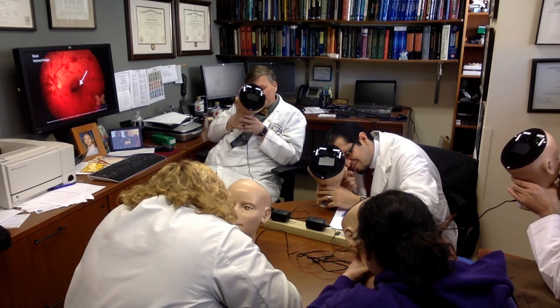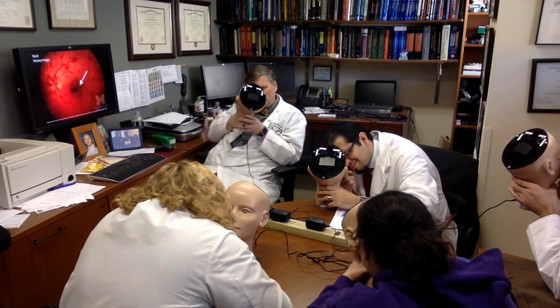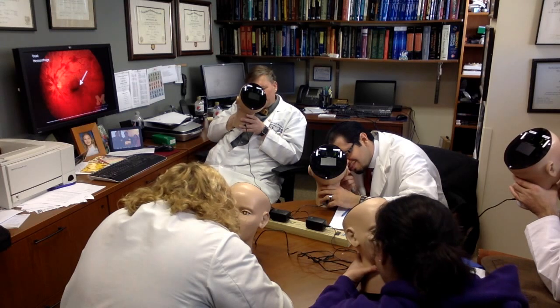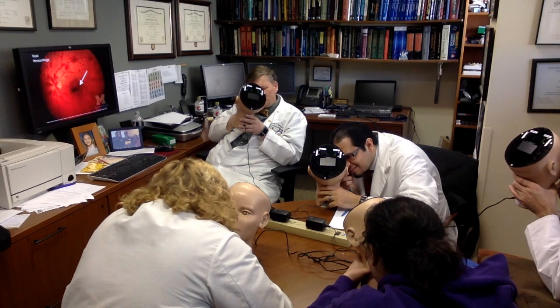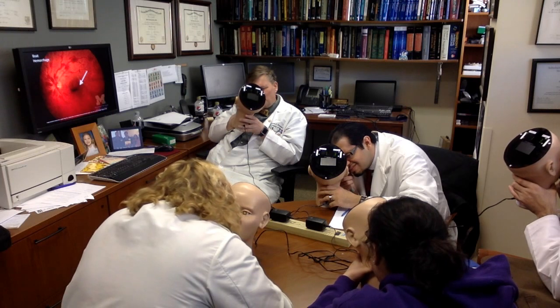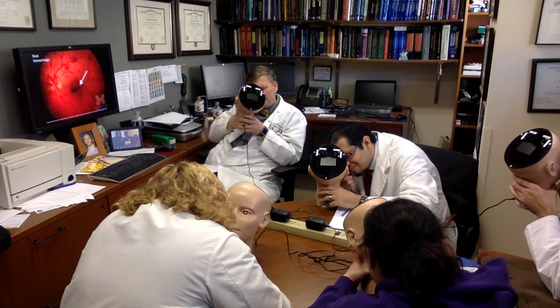It's pale. It's optic atrophy again. Okay. The whole retina is a little pale too. Do you agree? Now let's look at the blood vessels at 7 o'clock off the disc. How would you characterize those blood vessels? They're thin, delicate, and multiple, right? It's like a spider web, right? Do you agree with that?